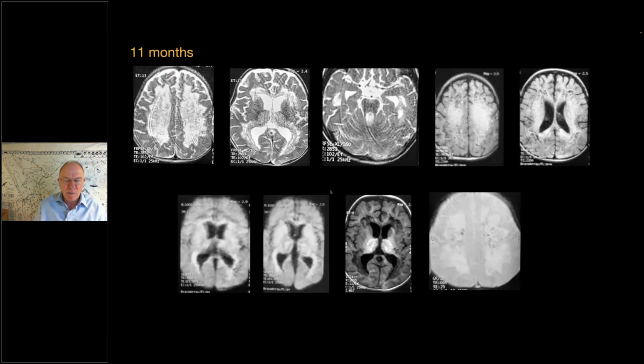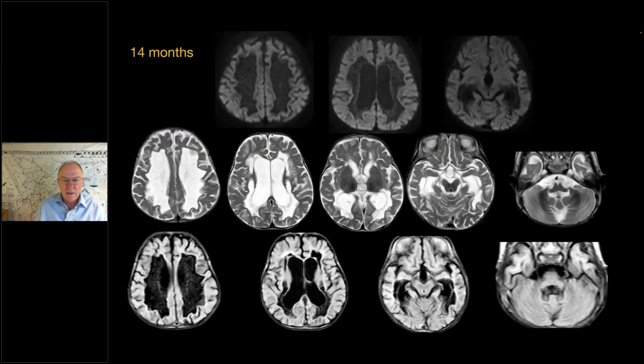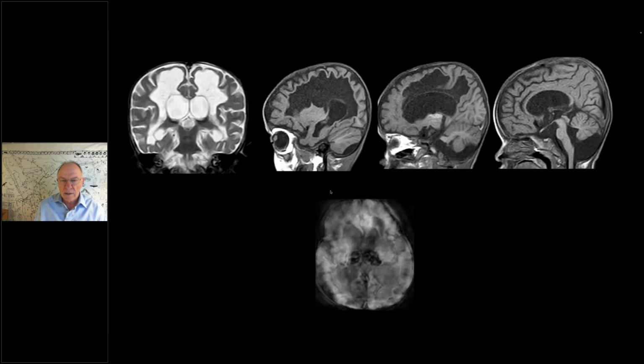I have no absolute suggestion. My gut feeling would be favoring an acquired condition, but of course I'm not sure. As I said, the initial MR was ANEC-like.